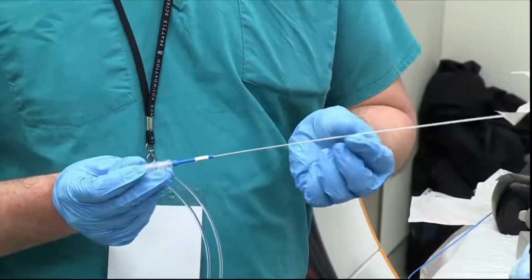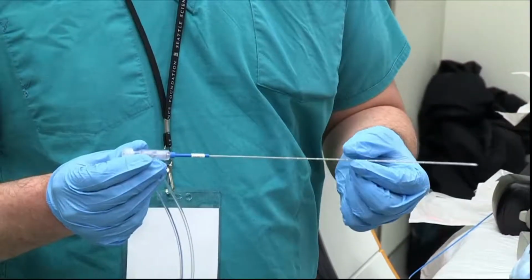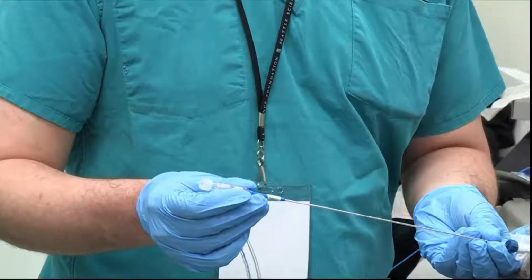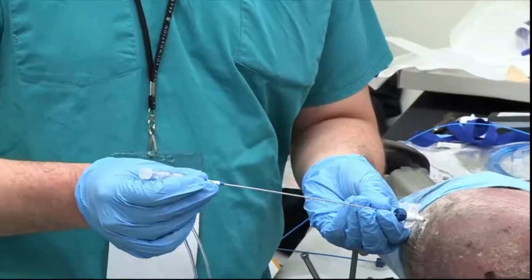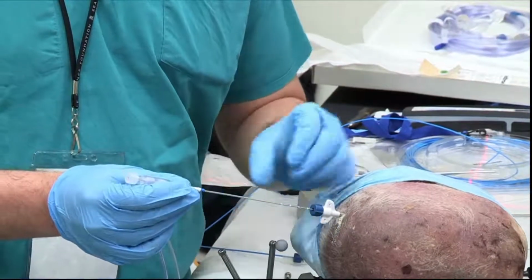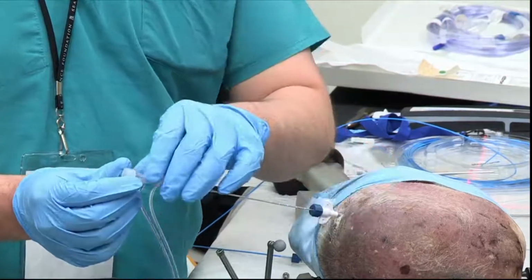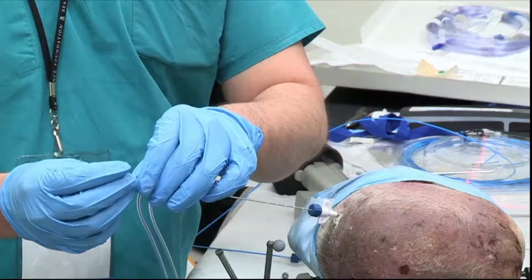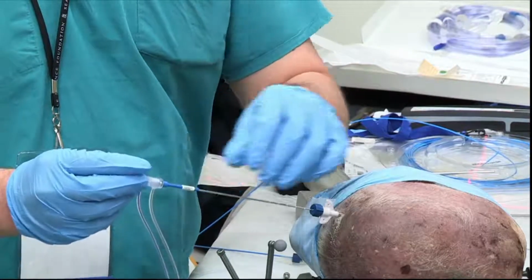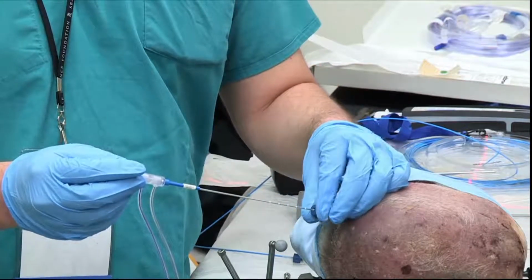We've also measured this to target. You can measure again. You don't want to forget, but ours was 150.5. We've measured that, and now we're going to place this to target. So let's say this was, and we've measured it. We're set. We're going to tighten that down just a little bit. Well, I'm sorry. We're going to actually get a CT scan now to make sure it's in a good place. We've confirmed that. Looks good.